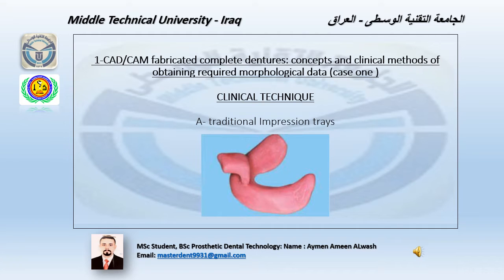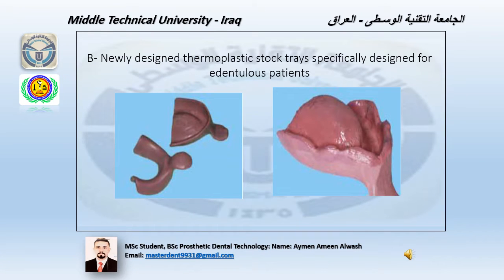This position may interfere with the lip or oral muscles, which leads to less fit or accuracy. This position of the handle, vertically and then turning inferiorly, can cause less fit and interference with the oral structures and cause defects during recording of the impression.